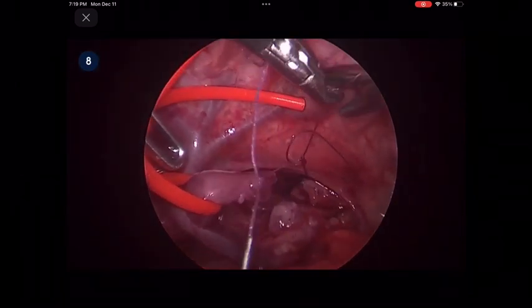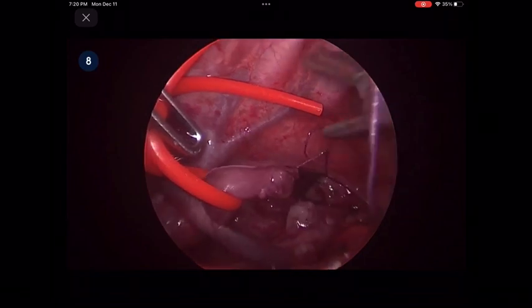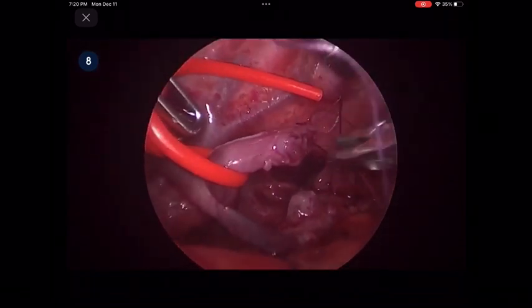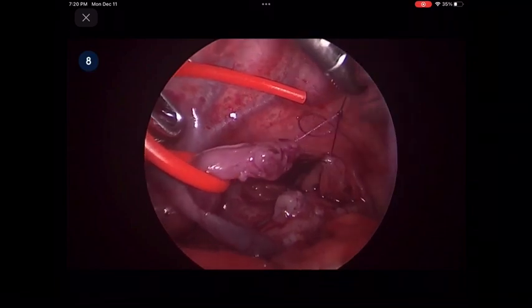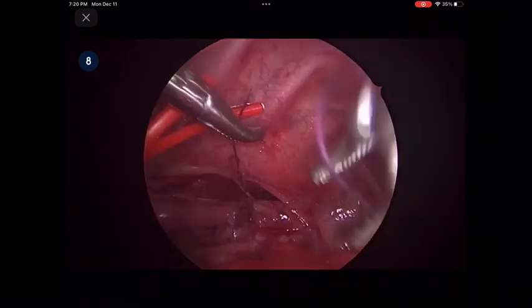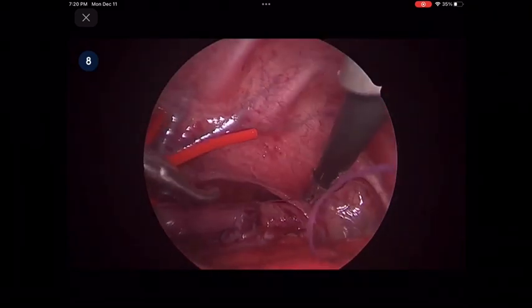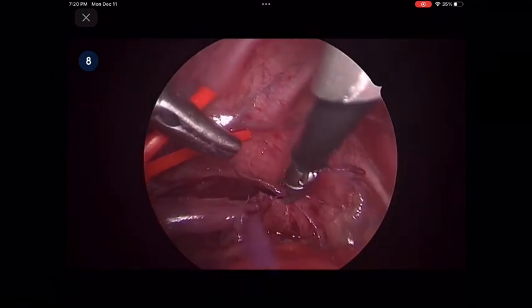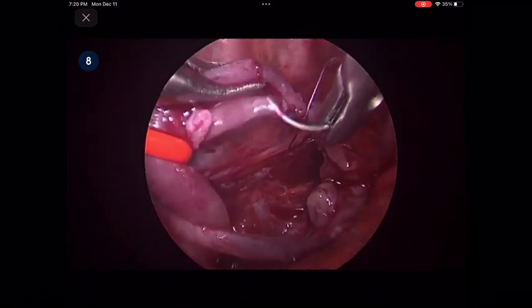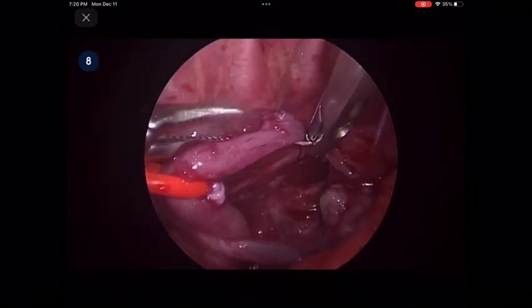Approximate the two ends of the anastomosis by throwing a square knot or sliding knot, depending on the distance between the two ends. Pull the knot slowly together to approximate the ends of the anastomosis, and secure the first suture with a suitable number of knots. The vessel loop is left in place to allow continued mobilization of the distal esophagus and help with forming the anastomosis.